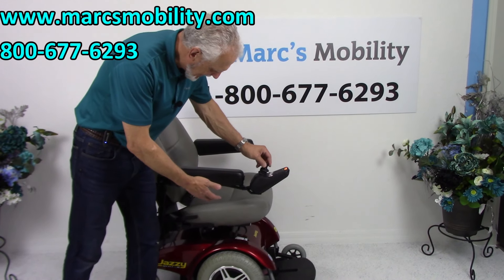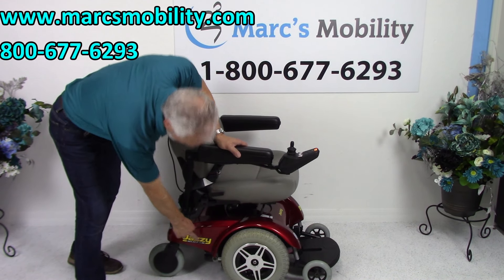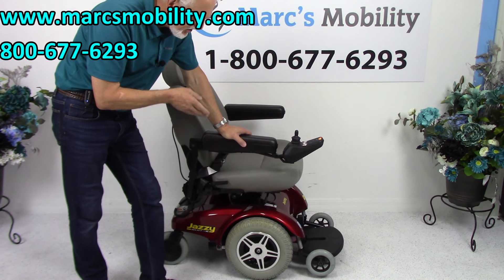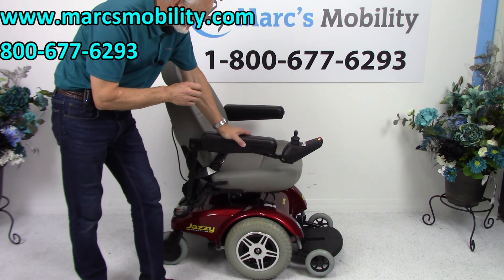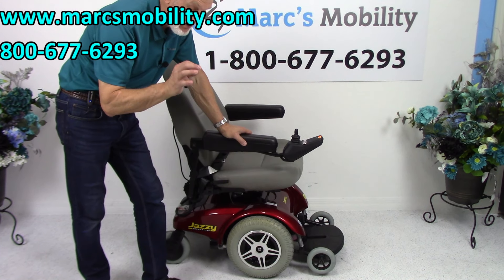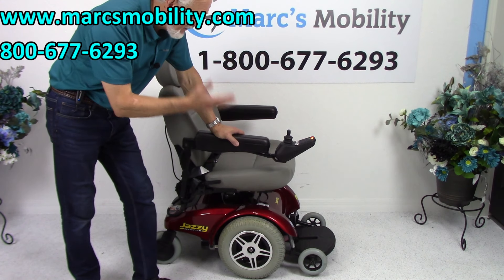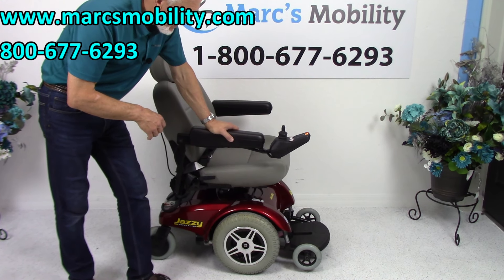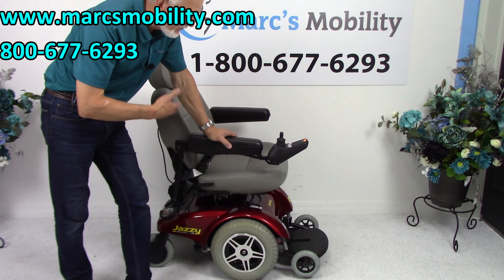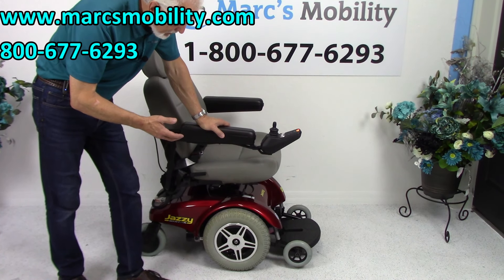This is the Jazzy Select 14XL. The XL stands for extra-large. This chair has a 350-pound weight capability. It's an extra-large power chair — not the heavy heavy-duty, but it does have a 350-pound weight capability. It's an older model. We have it here because it was a great find — it was sitting in someone's home. It has eight hours on it, so it's practically brand new. As you can see, it's a beautiful-looking power chair.